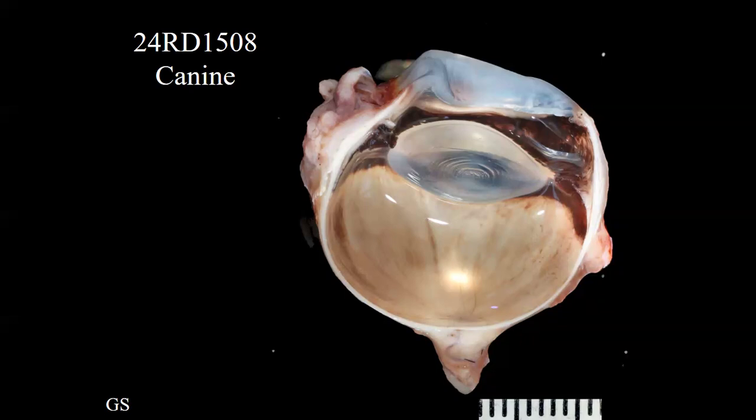When I held the globe in my hands when I was grossing it, I could not see the iris. But when I pushed gently on the limbus to try to pop the iris into view, because sometimes that works with a very dilated pupil, I still couldn't see the iris, but what I could see were the little finger-like ciliary body plicae extending in their normal anatomic location. It was really kind of cool to see that. But other than that, when I hemisected the globe, the choroid is very hypopigmented.